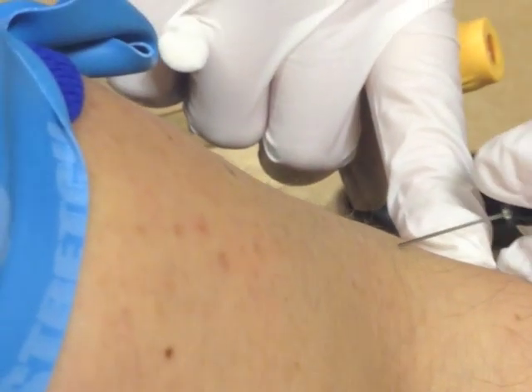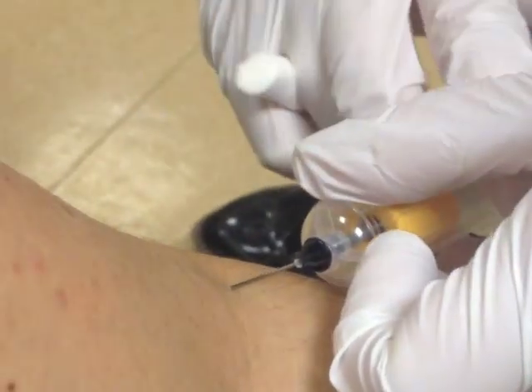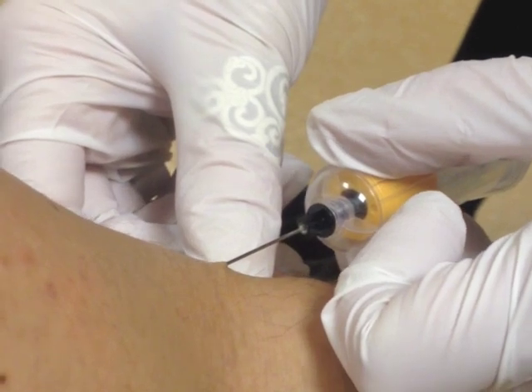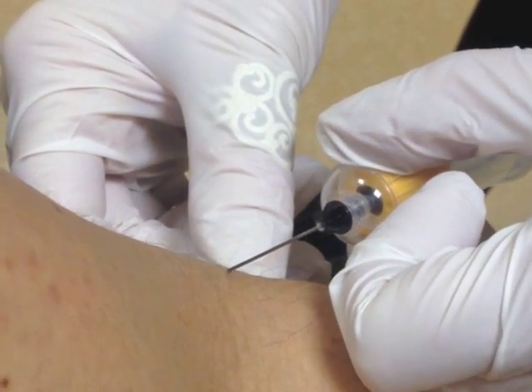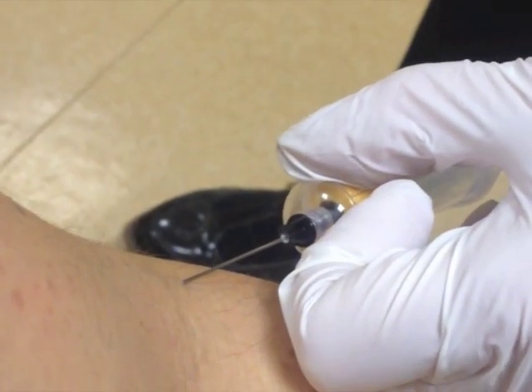The needle goes in — you'll see a bicep twitch, probably just tweaked a nerve as it went in. One of the vials there will start filling with blood, just through the vacuum — pretty simple. The vial has probably got EDTA or maybe heparin in it, just to stop it clotting while it goes off to the lab. That's fairly standard.